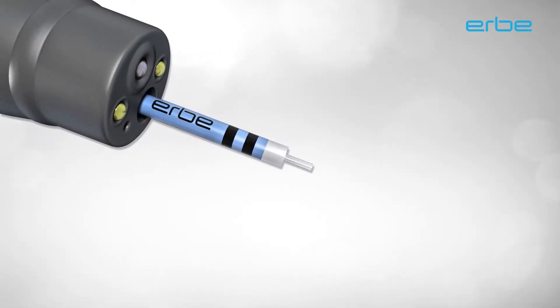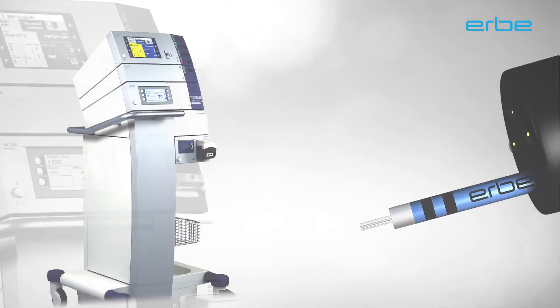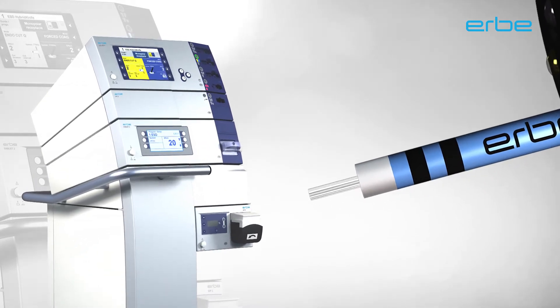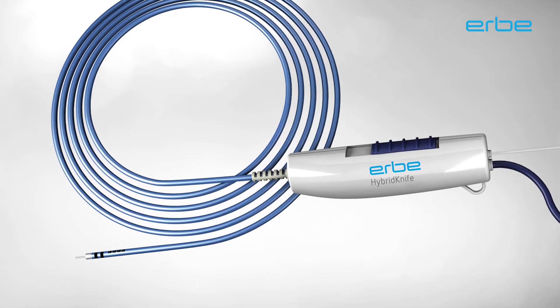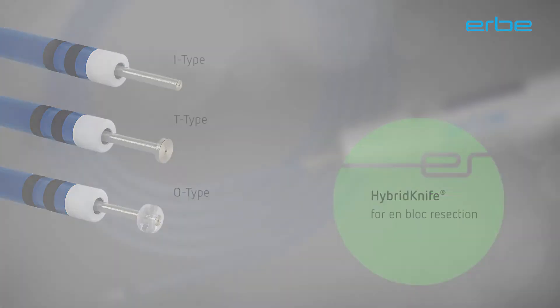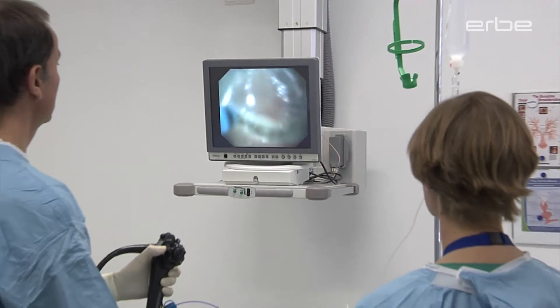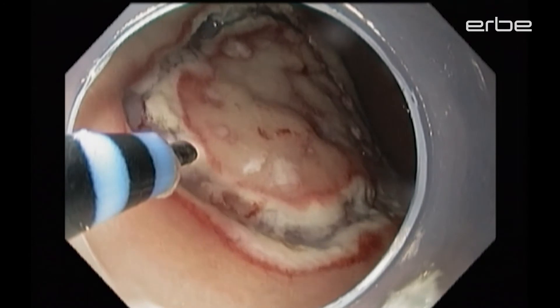With the hybrid knife, Erbe presents a global innovation. The hybrid knife is used for endoscopic submucosal dissection, ESD for short. The flexible probe makes performing this minimally invasive procedure much easier and minimizes the risks. The goal of ensuring R0 resections with a minimally invasive procedure can now be achieved faster and easier with the Erbe HybridKnife.